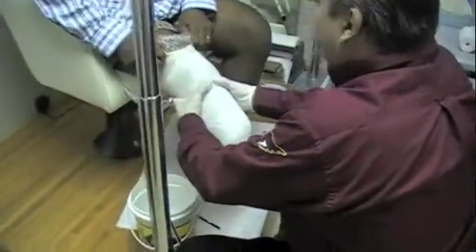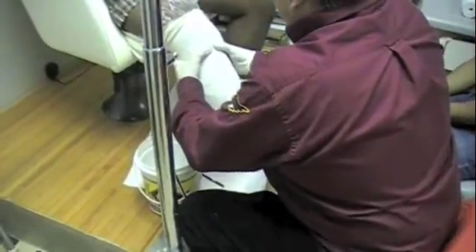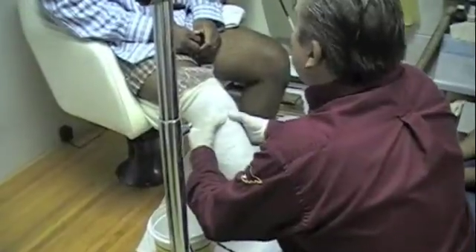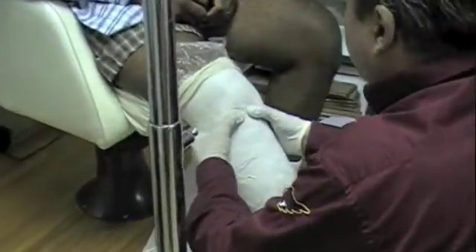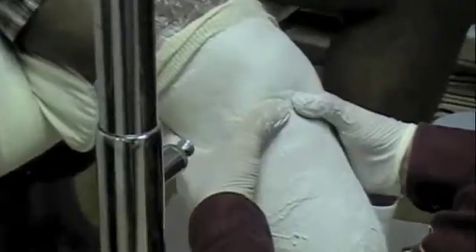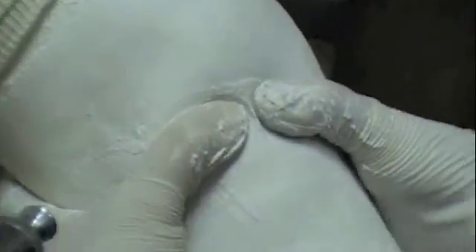Now I need you to let go of that socket and just relax your knee like you're asleep. The reason why I ask you to do that is because when you let the muscles loose, I can feel around and feel through the muscles to get to the bones. Because what you're going to do is carry a lot of your weight on the knee, and that's why you're applying pressure just below the kneecap. There's a little pressure on the back and a little pressure on the front, enough at the knee so you don't sink in too deep.